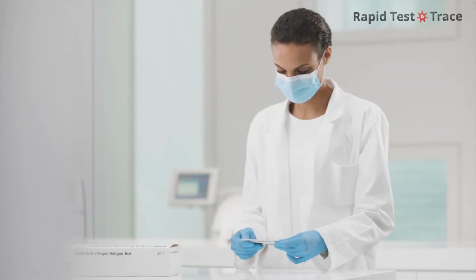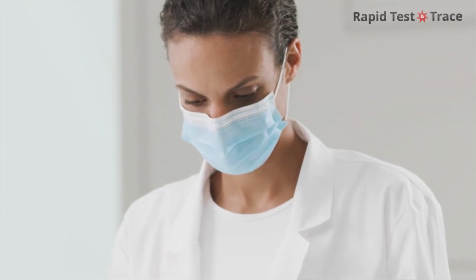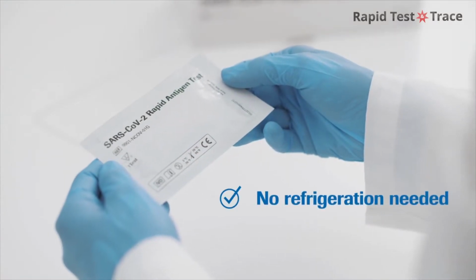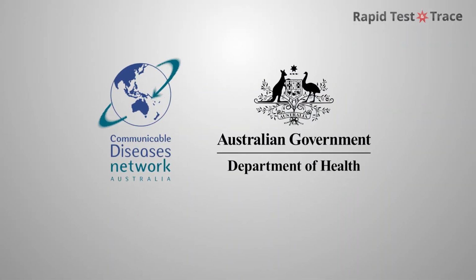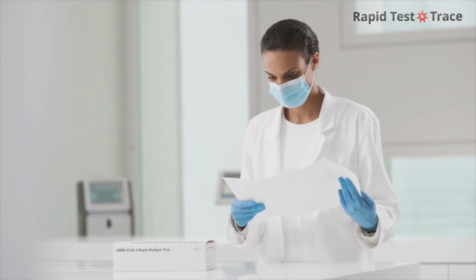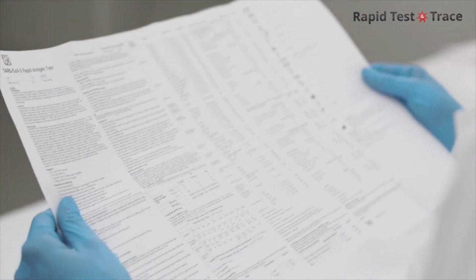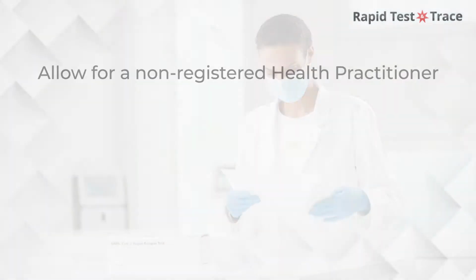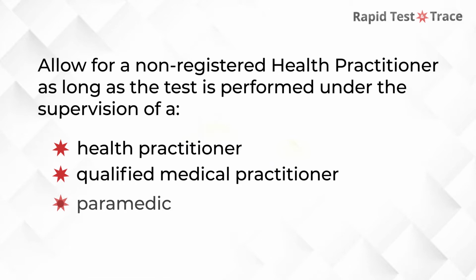The qualified or trained person performing the test is responsible for ensuring protocols are in place for notifying positive results, as per the national guidelines developed by the Communicable Disease Networks Australia, or CDNA. Even though the test is recommended to be performed by a registered Australian health practitioner, the Therapeutic Goods Administration, or TGA, does allow for a non-registered health practitioner, as long as it is performed under the supervision of a health practitioner, qualified medical practitioner, or paramedic.